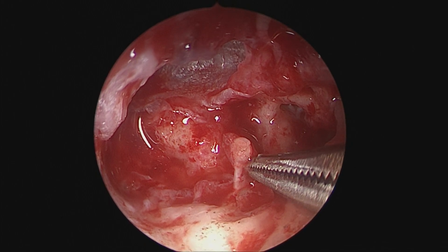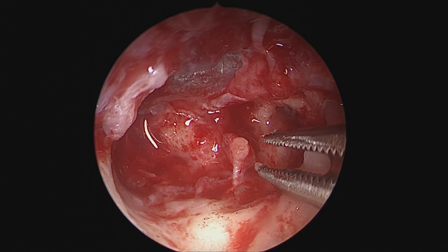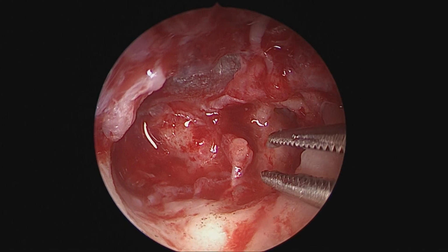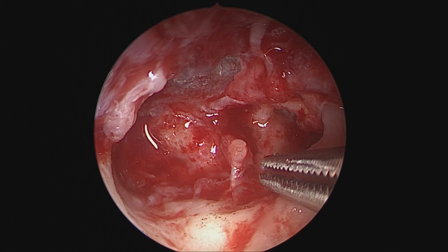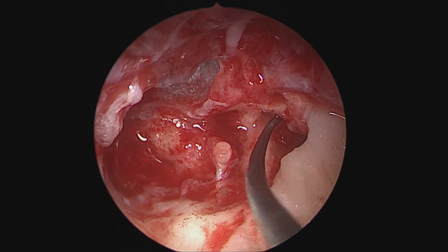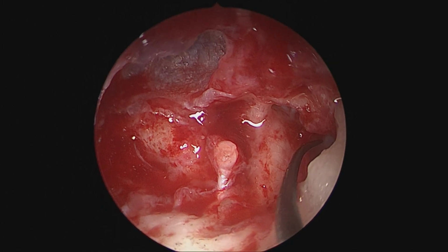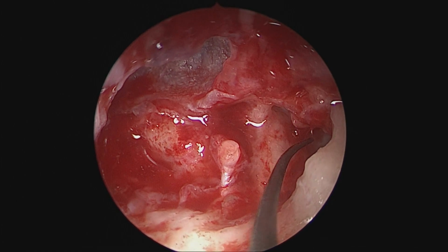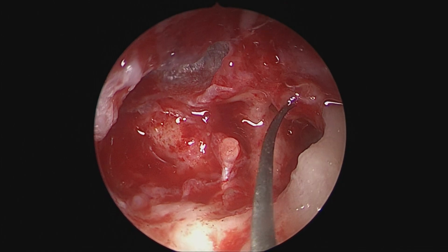So again, as we see that we are using a very fine microforceps to just bare the stapedius tendon and the stapes head in the end. This is to check the undersurface of the malleus head to see if there's any gross disease left here. There's not. There's just some excess mucosa which can be left behind.